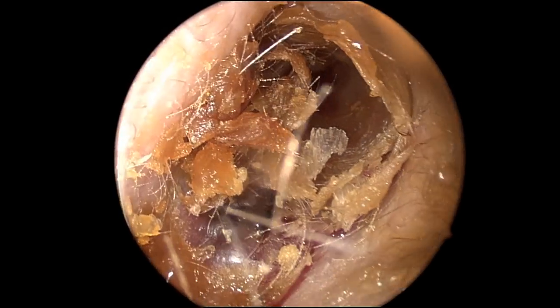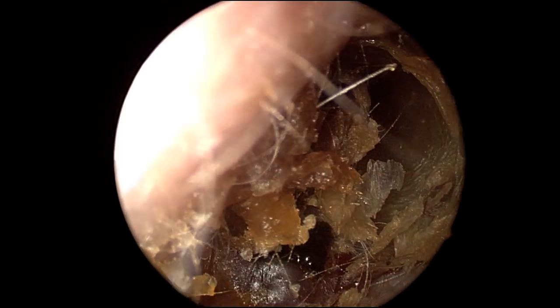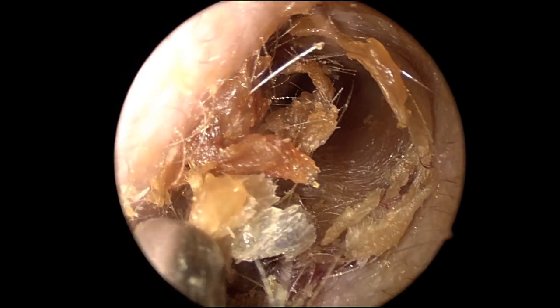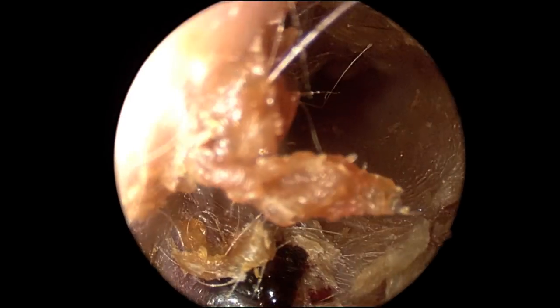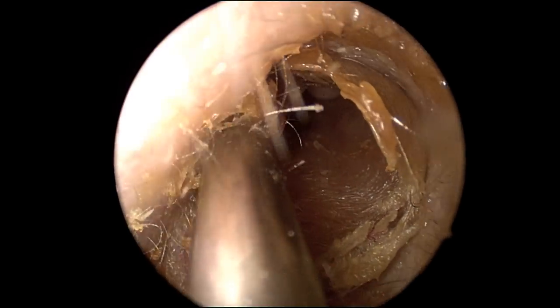Now we take a look at the contralateral ear. Here, with more obstructing cerumen, a suction is used to remove the majority of the cerumen.